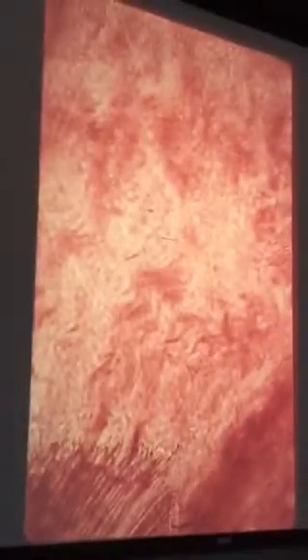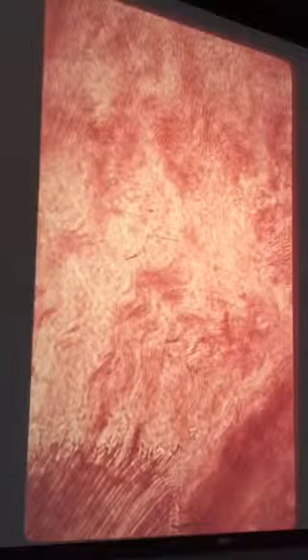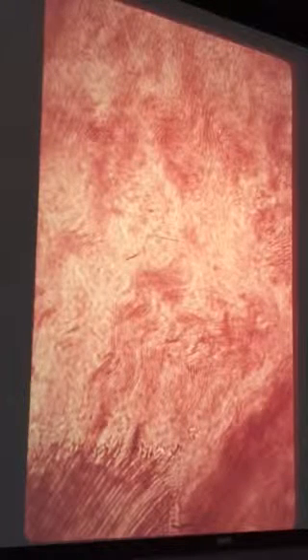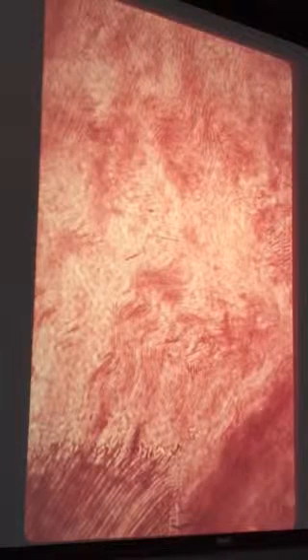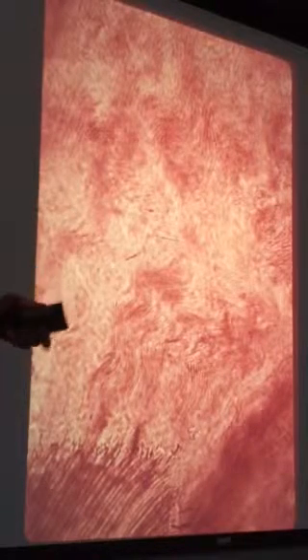And how about this right here? What is this classified as? Gnarled enamel. Okay, and another example of gnarled enamel. In fact, you can see those enamel rods twisting. So that gives the appearance of the gnarled enamel. And that's normally found where? Cusps.